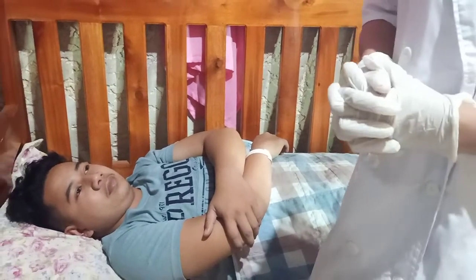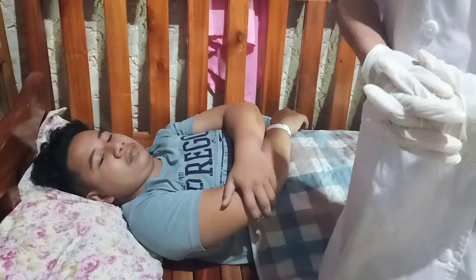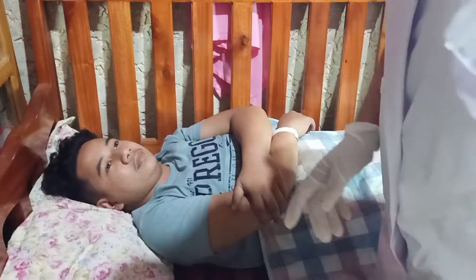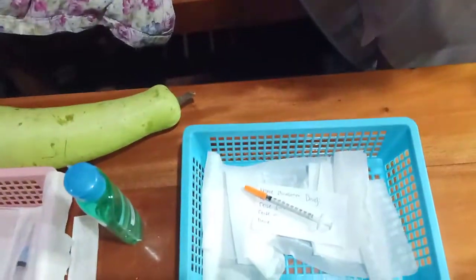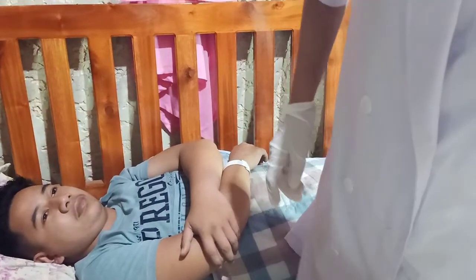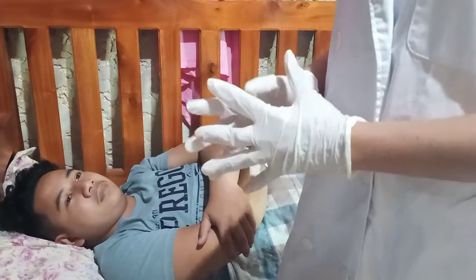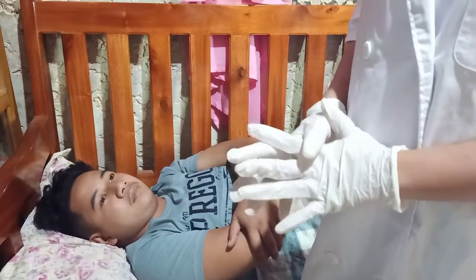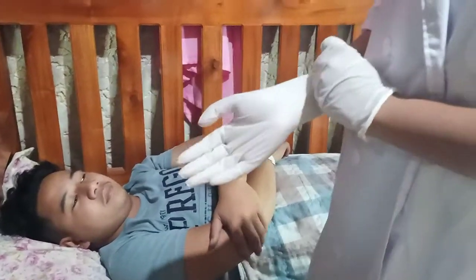So, before we start, we need to perform hand hygiene, and arrange the medication card and the drug in the medication tray. So now, determine what site will be used and expose the potential injection site. So now, inspect the area for any bruising, inflammation, or edema.